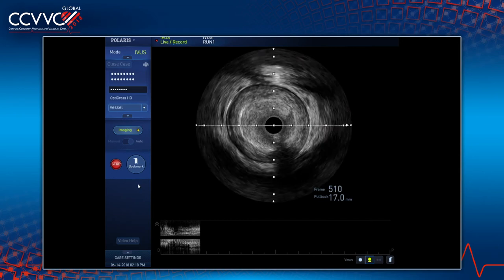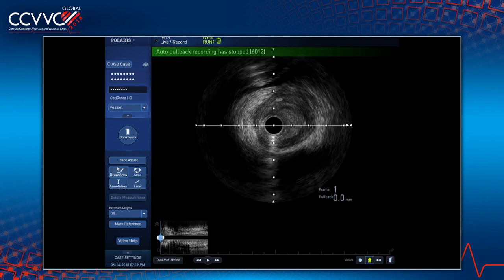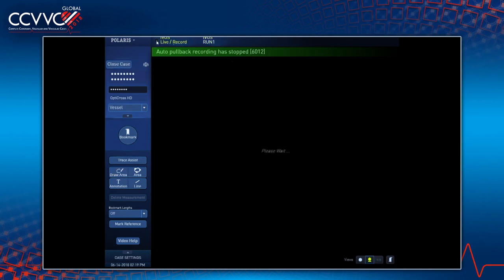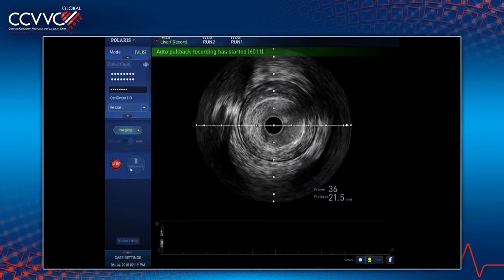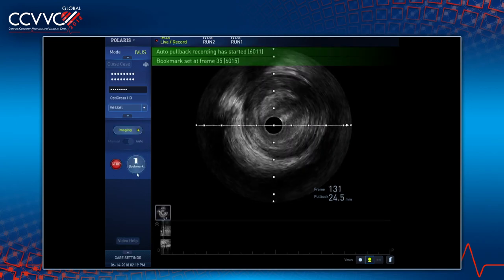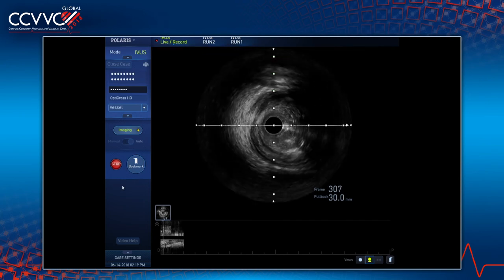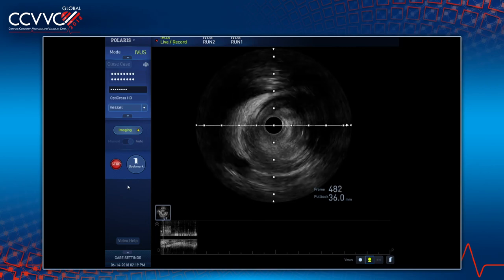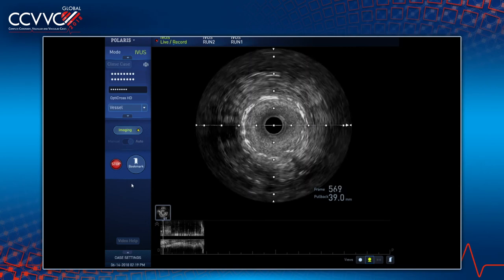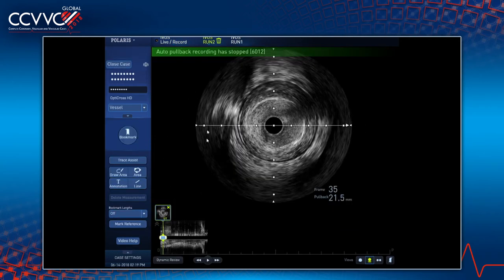But okay, stop there. Where are we now? So stop means no. Bookmark. Okay, give us the record again. After the end, bookmark and give us a vessel size here. All right, and following this IVUS, you're going to tell us your stent choices, and right after that we're going to cut the loop. Look at the diameter here. I think at least a 3.5. Yeah. All right, I want to go long, 3.5 in the distal vessel, and we're going to go to room 2 right now and come back later to see the final result. Yes, go to room 4.